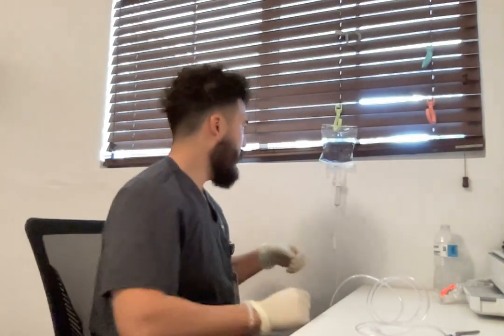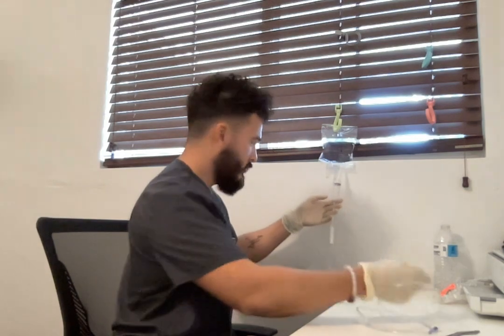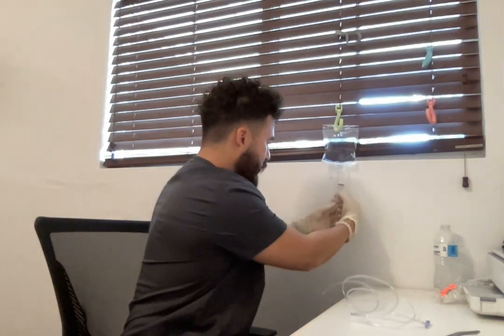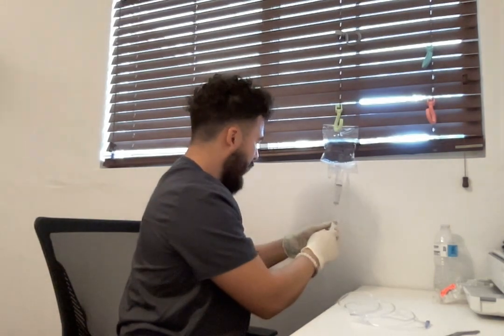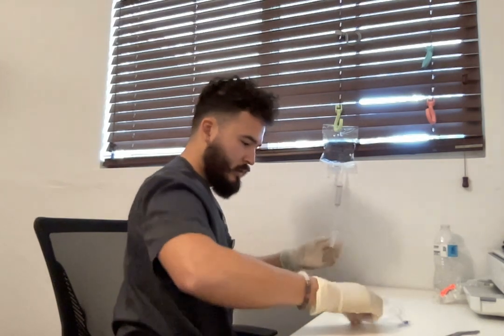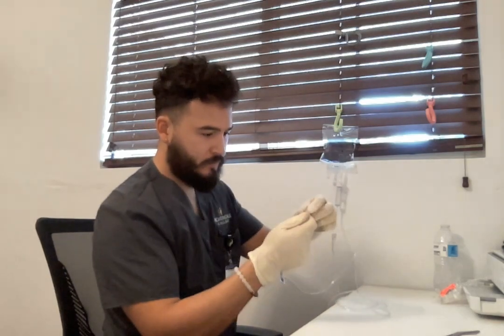Move my camera just a little bit. All right, so I have my bag hanged, fully clamped. Now I am going to squeeze the drip chamber so fluid comes halfway. Okay, we get about halfway. And then I'm gonna slowly release the clamp and remove the cap on the adapter at the very end.